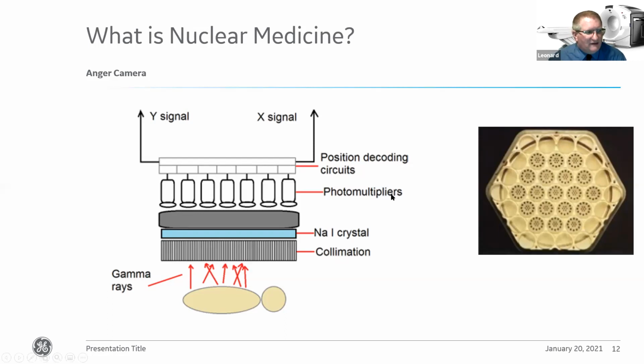The other thing that we had when we had the first type of gamma camera is a setup on here. What we're demonstrating is the fact that the photomultiplier tubes sit within each of these holes, and the actual crystal section is this bit underneath here. You see we've got a circular crystal, and the PM tubes that we're utilizing have to go outside the area of the crystal so that we can detect every single event. When we get an incident photon, it will strike more than one photomultiplier tube, but the system will be able to detect exactly what's going on and assign a given value to a specific light event for a particular gamma ray. So it'll exclude any adjacent tubes picking up, to make sure we're really accurate on the event.